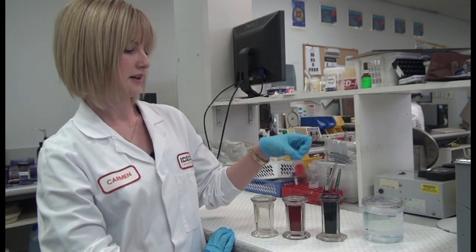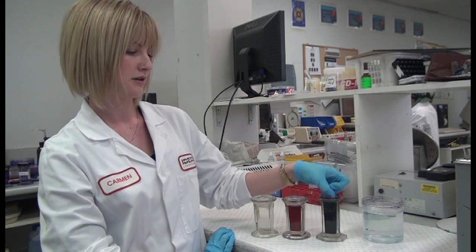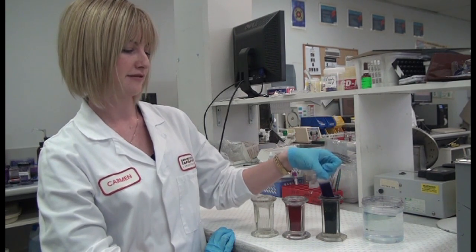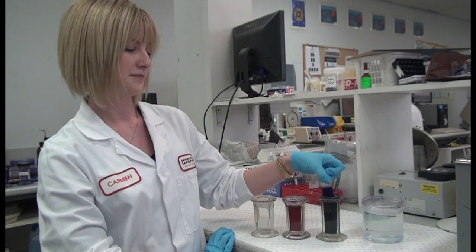Drain off the excess. Then ten dips in dip two. One, two, three, four, five, six, seven, eight, nine, ten.